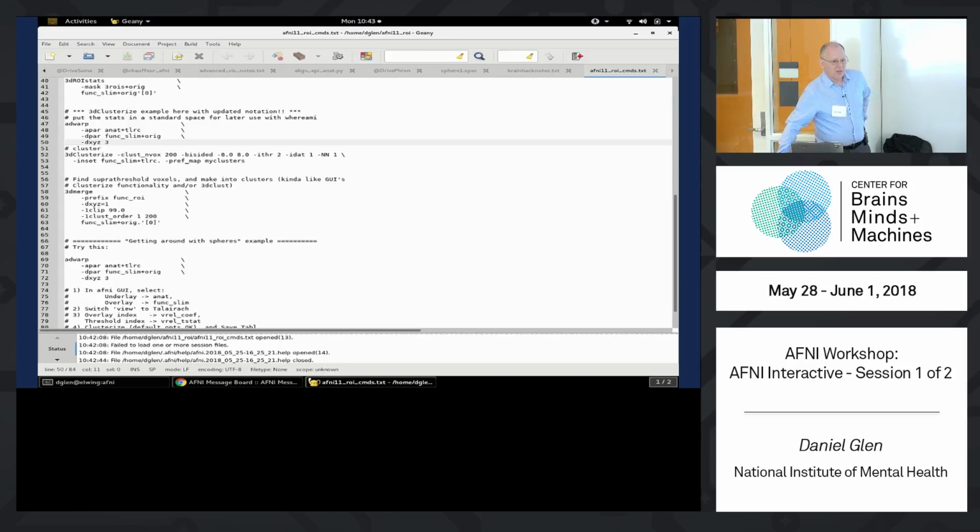Is it better to be running all this with T-shell or Bash? We write most of our software in T-shell, but I don't think there's any requirement that you be in T-shell also. Having said that, a lot of times it's better to set up the environment variables in both Bash and T-shell if you're using Bash.